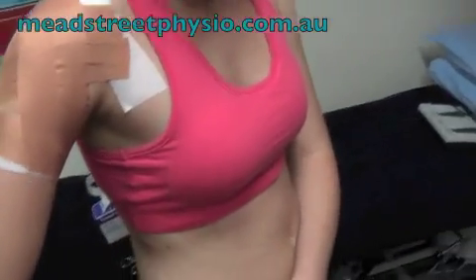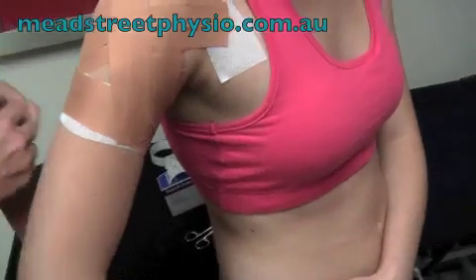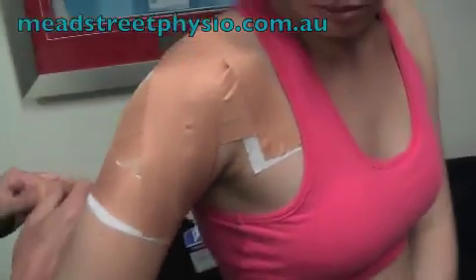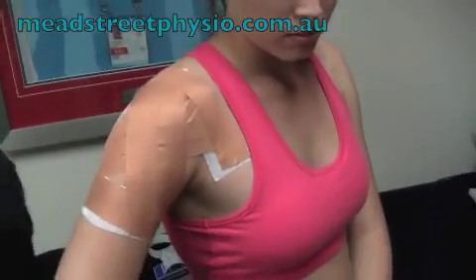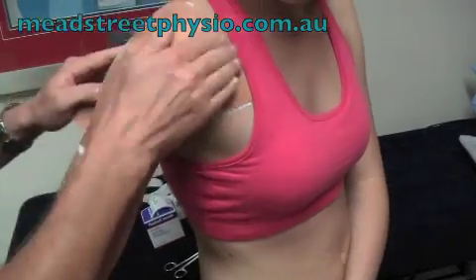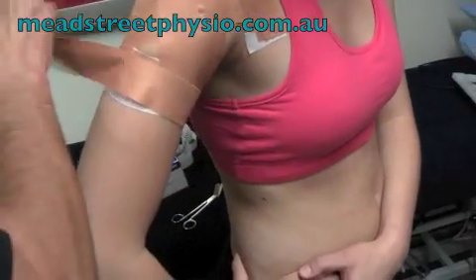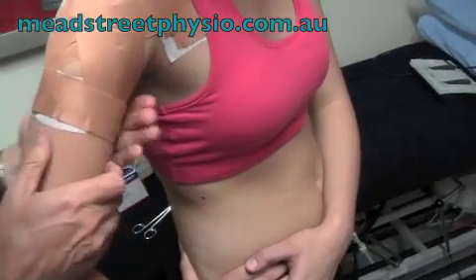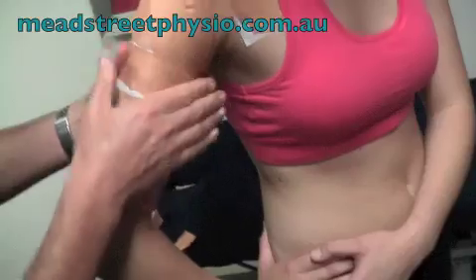Good. All right. And then we'll lock that tape off at the top there so it doesn't peel off. This lock off tape doesn't have to be hard. I usually put a couple of those strips across the top there to help lock that off. And I might put one more around Jess's arm there, again just to lock it off nice and lightly down the bottom, making sure that's right around the arm.